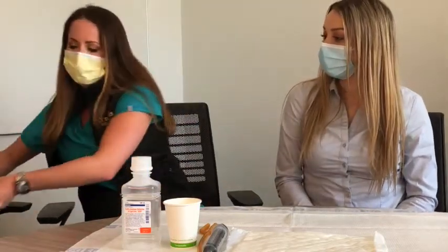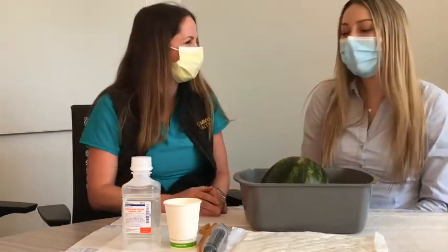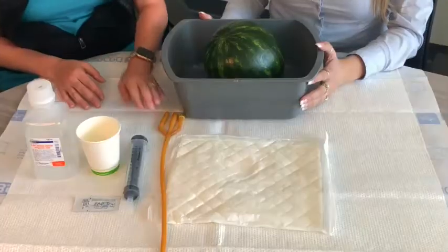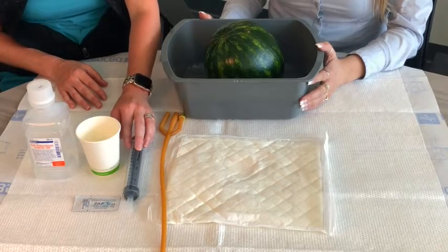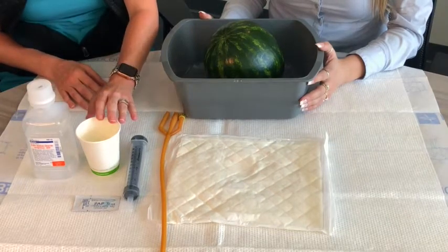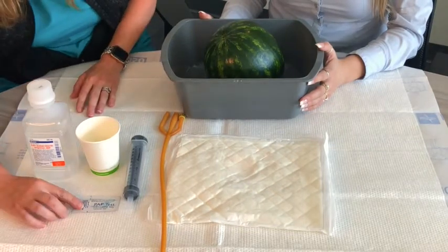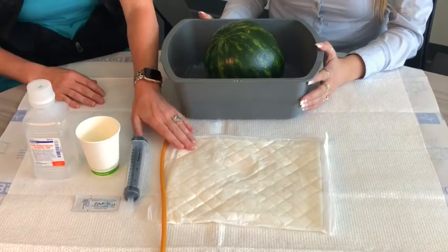I've got an idea — let's use this watermelon for the demonstration. So you'll need a catheter that may be yellow or red in color, a catheter tip syringe, some normal saline solution as well as a cup for drawing up your solution, some water soluble lubricant, a basin, and a towel or absorbent pad.